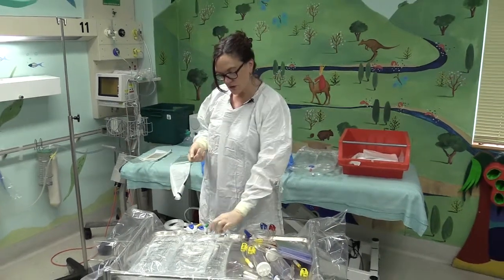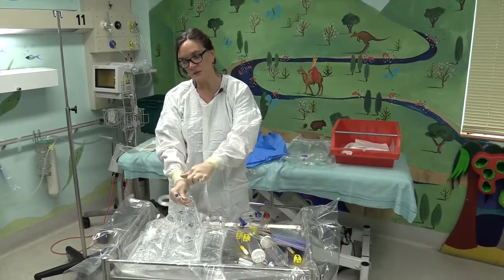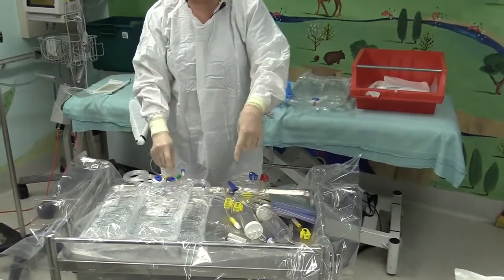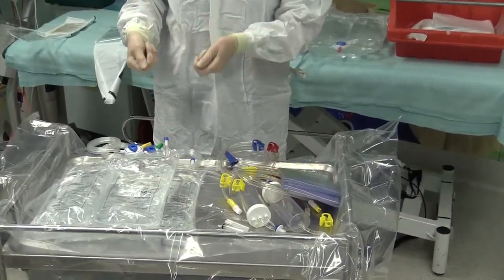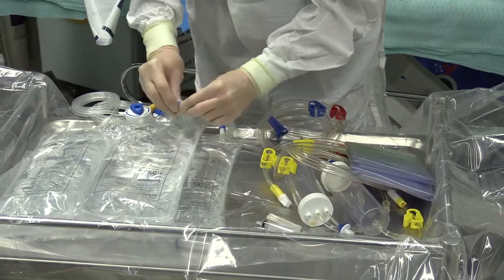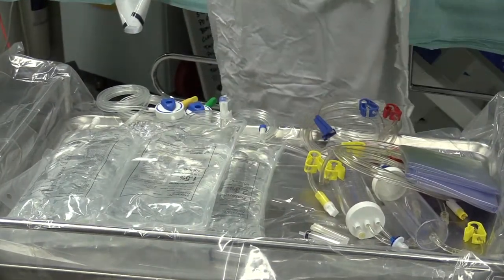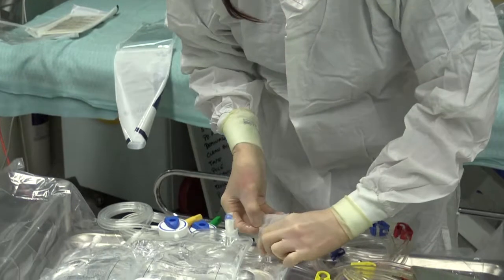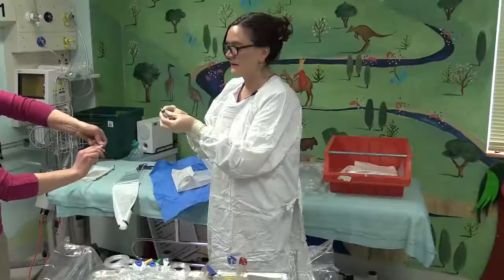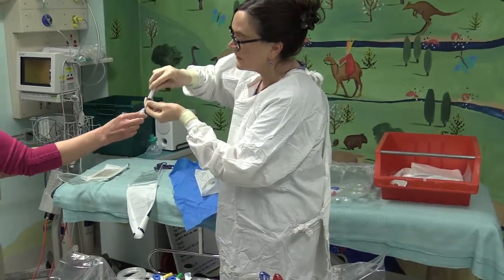To do that, I'm going to first of all wrap the injection port. So the blue port is the injection port. I'm going to wrap the injection port with an alcohol wipe. Then I'll draw up my heparin and I will add it. Okay, so just wrapping the port and repeating that with the other bag. And it's heparin 1000 units per ml.